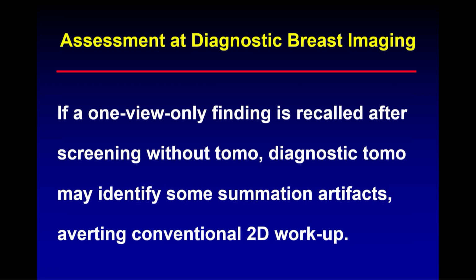Now, there have been studies, and very well-designed studies, showing that there is equivalence for using synthetic mammo with or without 2D, which has led many practices to drop the 2D because there's less storage and it's lower radiation dose. It makes sense. The problem is that those studies looked at equivalence, non-inferiority studies. Well, we know that tomo shows more than 2D.